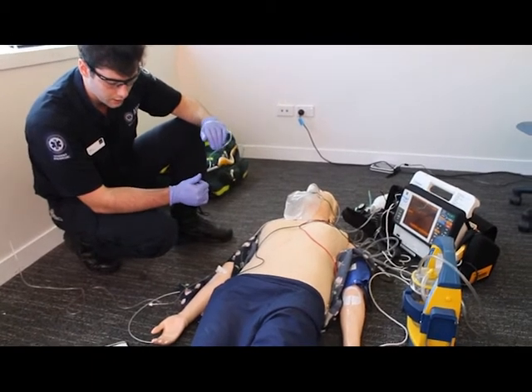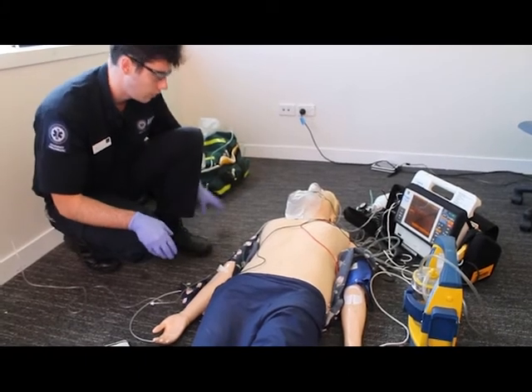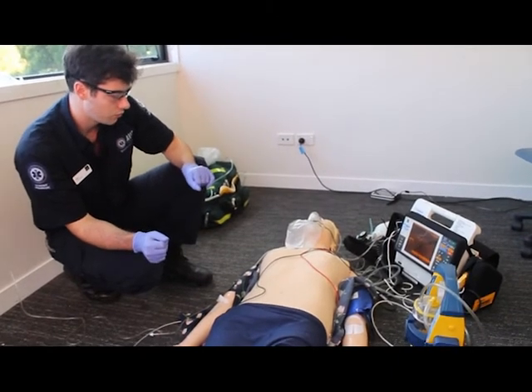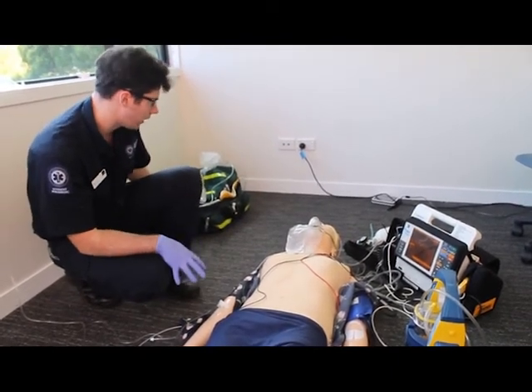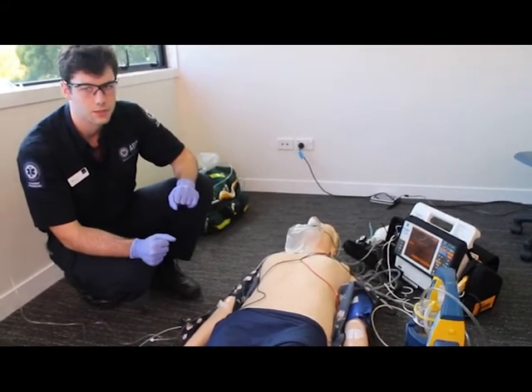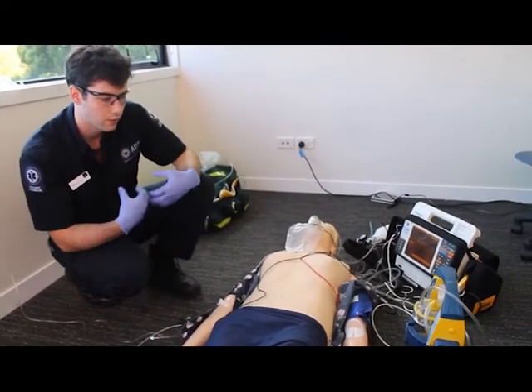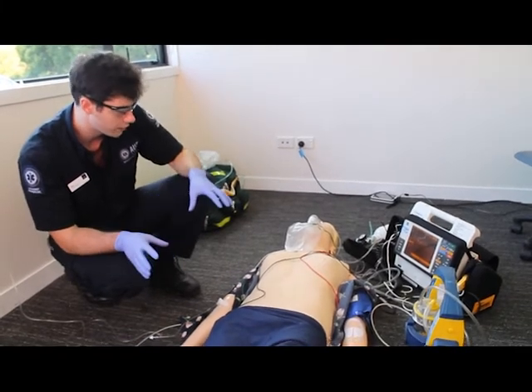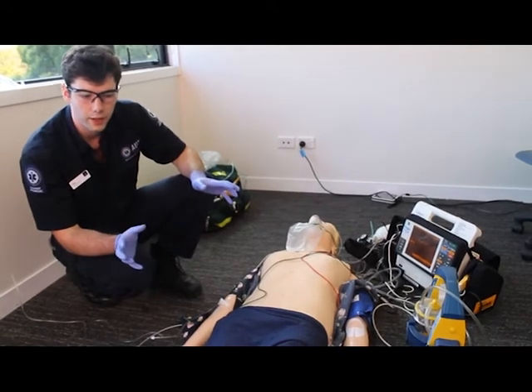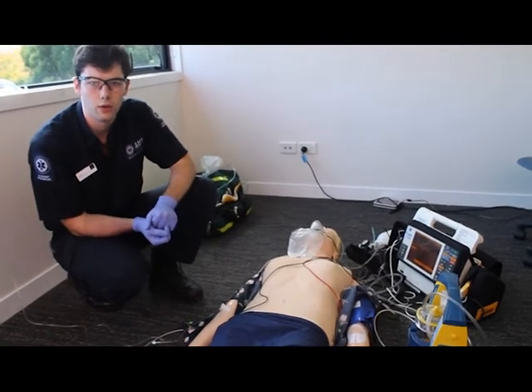I've got a full second set of vital signs, and I've generally prepared the area, leaving a space next to the patient's head where the ICP can lay out the intubation roll. I've also left a space generally around so that if any junk gets put anywhere, we've got a bit of space. At the moment we're in a residential address, so we've got plenty of space. However, if we were in the ambulance, I'd want to minimise any junk or bits and bobs that could get in the way. And if we were in an ambulance, we could also start thinking about driving and meeting our R50 on the way.